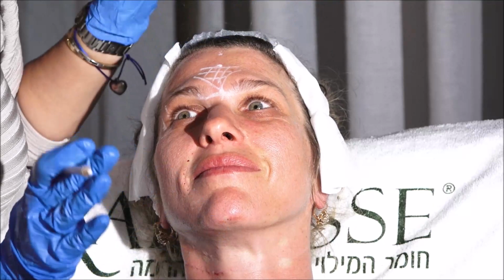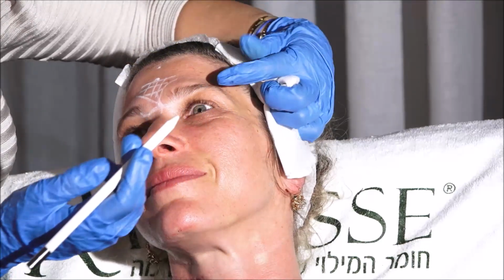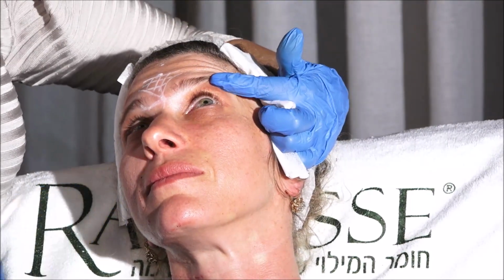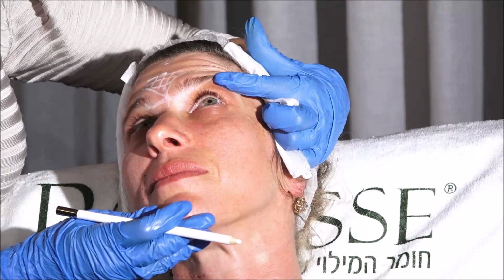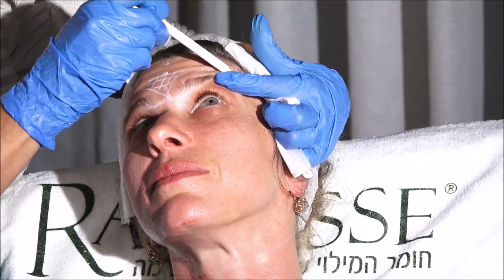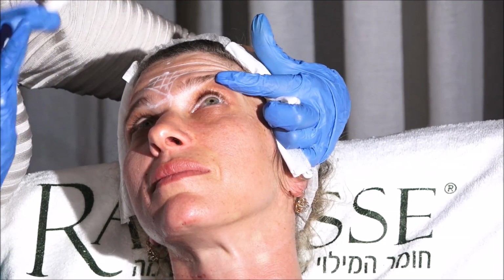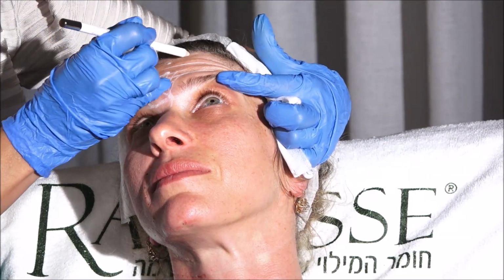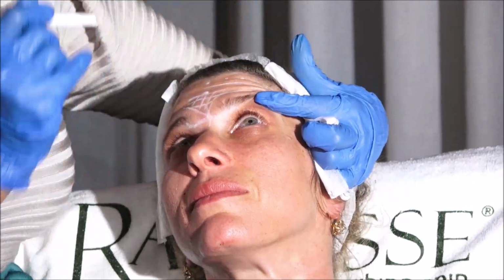You want natural, not frozen, right? Yes. Natural. So 2 centimeters of distance laterally. Contract for me. What I do is that I just grab for them not to be strongly. So I just put my finger and grab. So this is the danger line. This is the C line, just for us to know the depth.